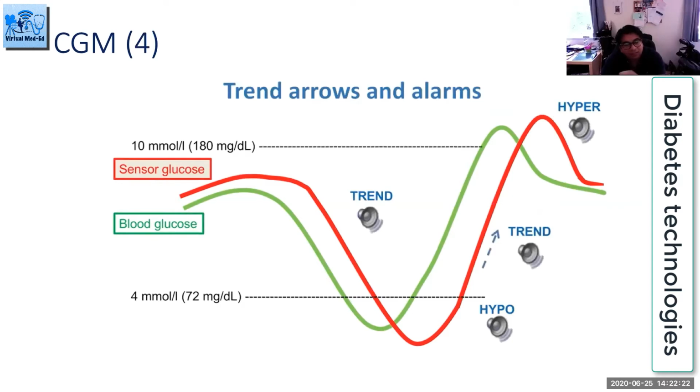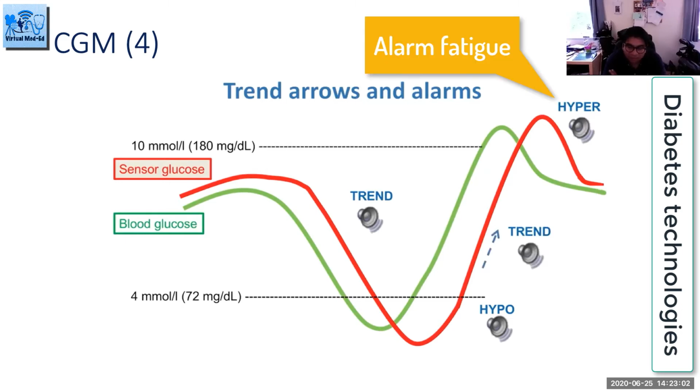And then if you're on CGM, any rapid change in the sensor glucose, depending on your setup, will lead to an alert. And we can set the alert at what thresholds you want it to come into play. And there's some predictive element that you can put in as well to pick it up way before they hit the low threshold. And that applies to the high alerts as well. I mentioned earlier to be very careful with the high alerts, because normally when a patient is new to CGM, I try to ignore the high alert settings, because if you get too many alarms, the patient gets alarm fatigue. And again, you start to switch off.